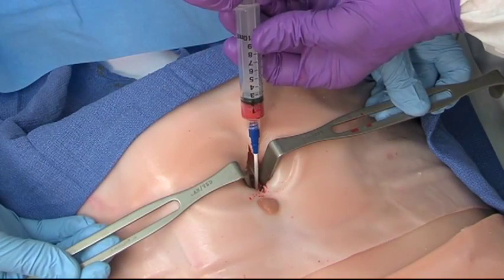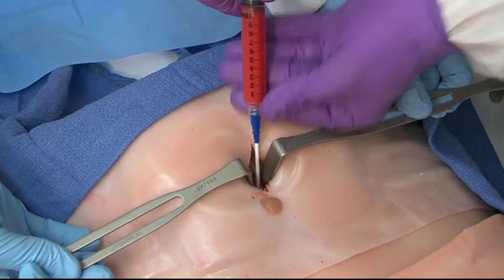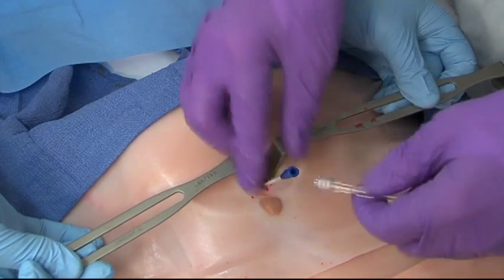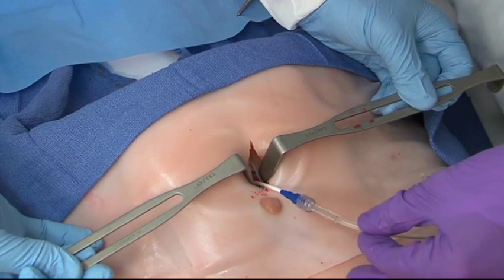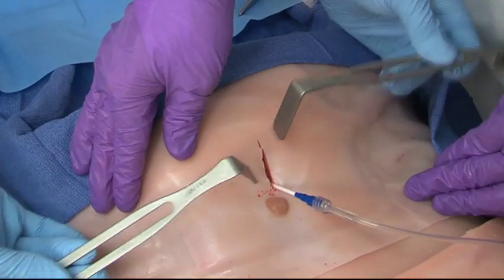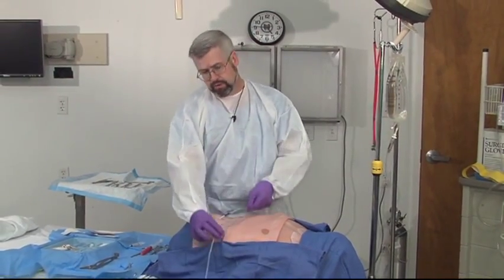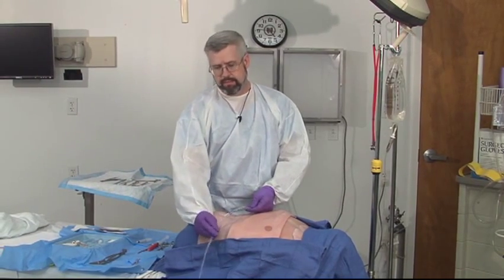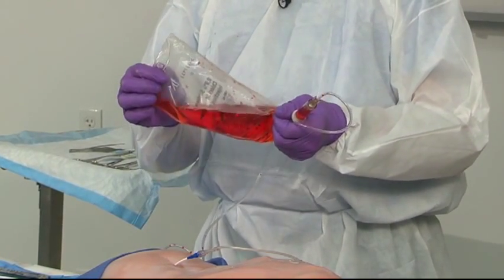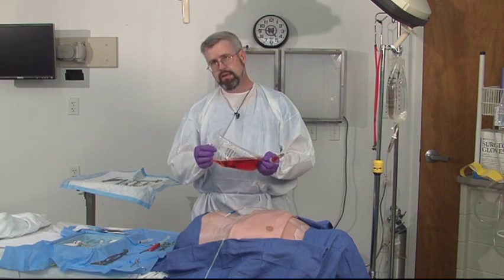Now the catheter is in the abdomen — we're going to aspirate, and as you see, this looks like a positive tap as there's about 10 cc's of blood coming out. If this tap were negative, we would attach IV tubing and run in about 700 cc's of warm saline into this patient, slosh the abdomen around to allow the fluid to get into all the spaces. Now we've got about 700 cc's of warm saline in the abdomen. I'm going to take this bag and drop it to the floor and let the fluid run out. We'll send this fluid to the lab: if there's more than 100,000 red cells or more than 500 white cells per cc, this patient would be considered to have a positive tap and would likely need an exploratory laparotomy.